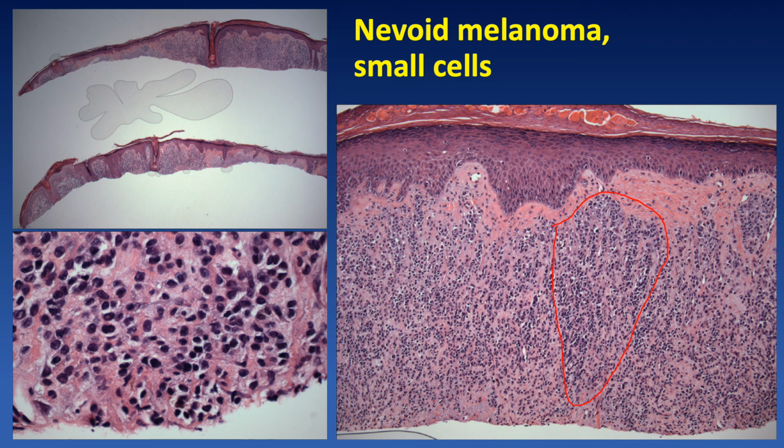Note also the lack of an overt in situ component in the overlying epidermis, which moreover is hyperplastic and crusted, suggesting external trauma. So in this case, it's a little bit of a slippery slope, like the special site nevi. How much can you attribute to site-related or external trauma that might be obscuring the true nature of the melanoma?